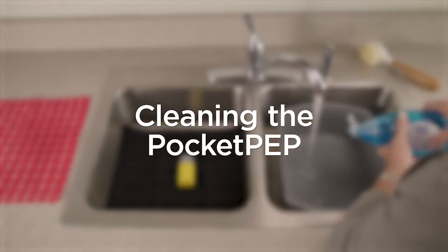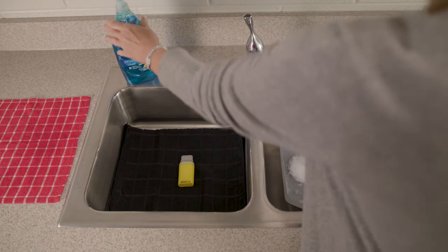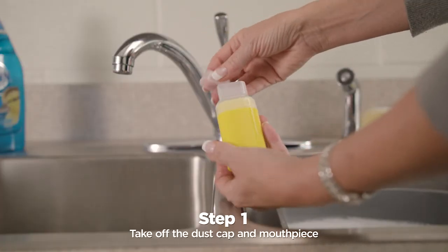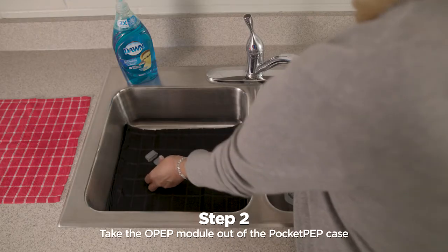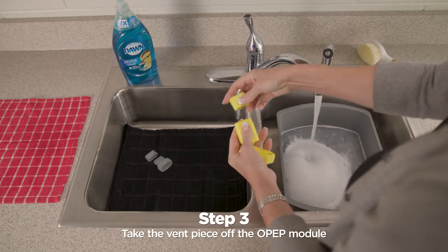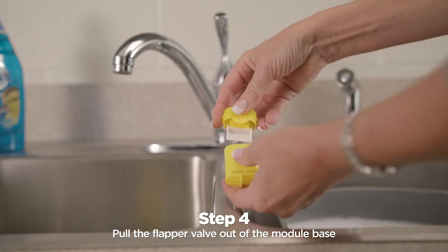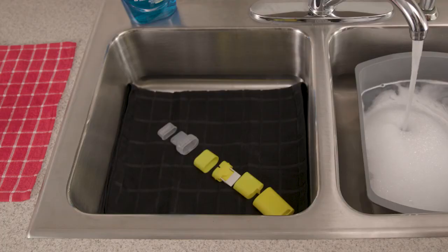You can clean the Pocket PEP in warm soapy water. You can use liquid detergent such as Dawn. Take off the dust cap and mouthpiece, then take the OPEP module out of the Pocket PEP case. Take the vent piece off the OPEP module and pull the flapper valve out of the module base. Make sure that you have all six parts.